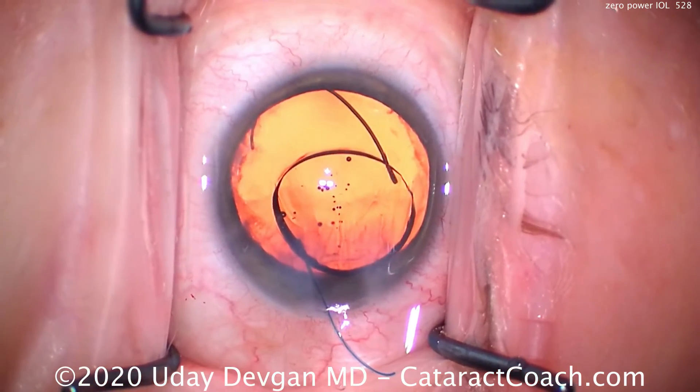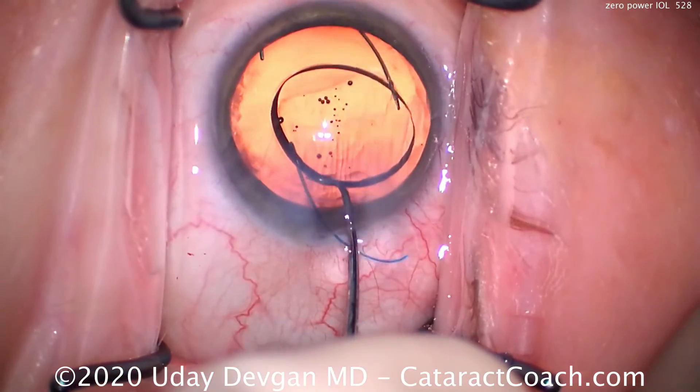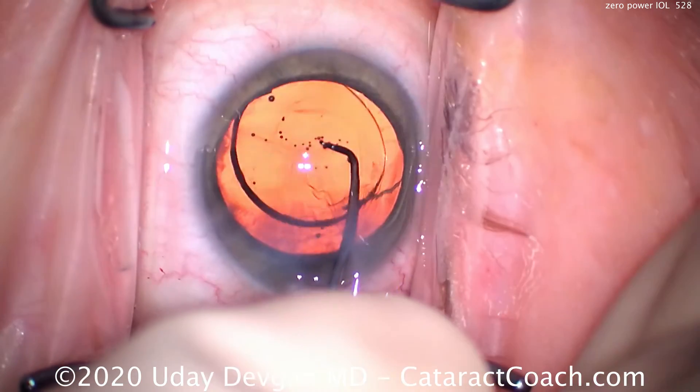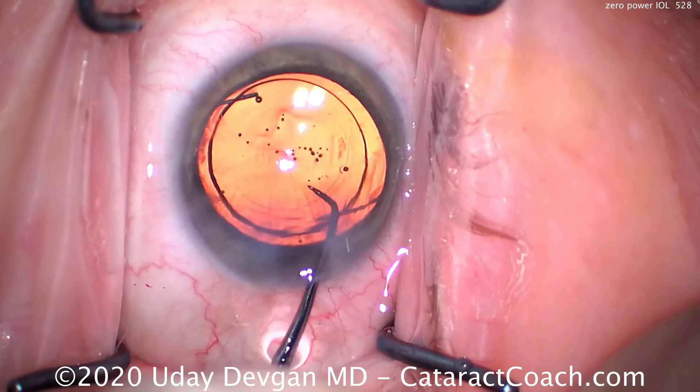Very thick. And now we'll dial in that trailing haptic. The haptics are in the anti-S configuration — that's the correct configuration. This lens does have a vault to it, so we definitely want to get it in the eye correctly, even though it has no dioptric power.